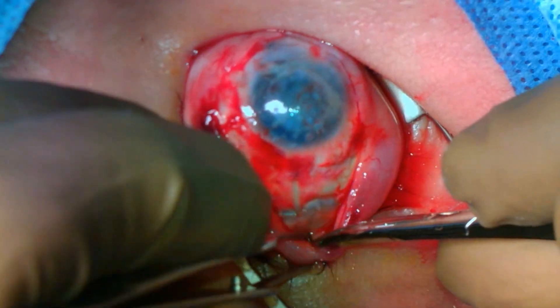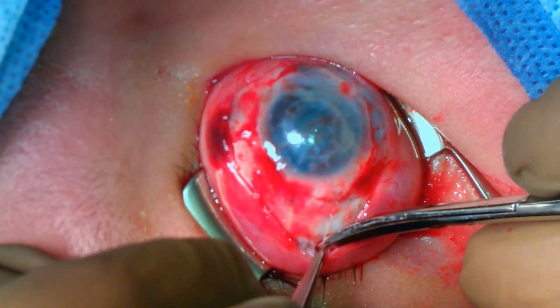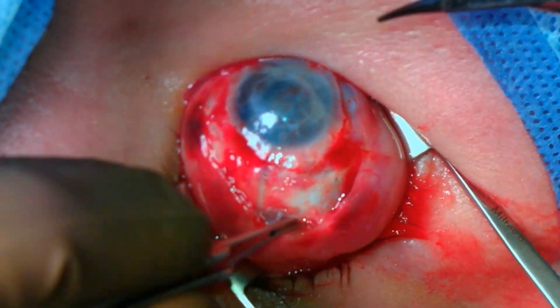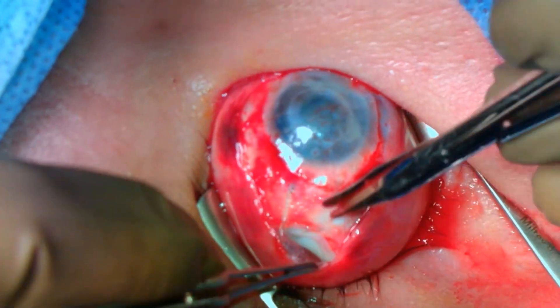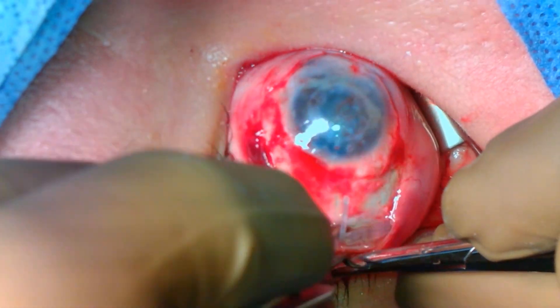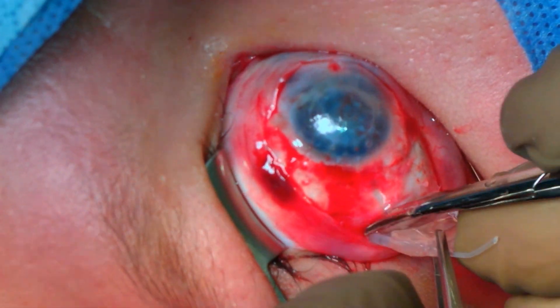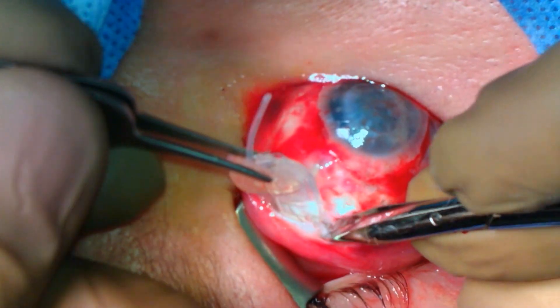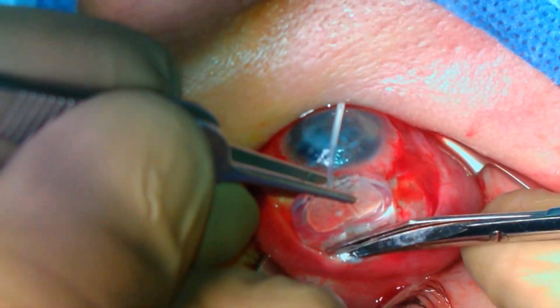Blunt Westcott scissors are then used to dissect beneath the implant along the surface of the sclera. The tube is prolapsed from the eye, which can result in the eye deflating. The medial and lateral edge of the implant are identified and dissected from the adjacent tissue. Additional dissection is carried out on each side of the implant.